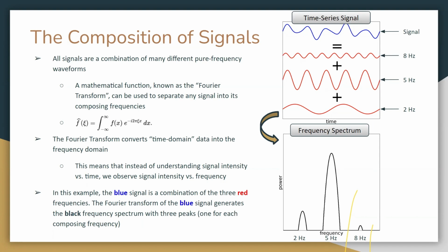Anything can be represented like this. This is a form of mathematics called Fourier analysis. And the most important equation in Fourier analysis is probably the Fourier transform. Might be the most important equation ever. We use this technology in our cell phones for communications, in radar, in EEG processing, and many, many other things.